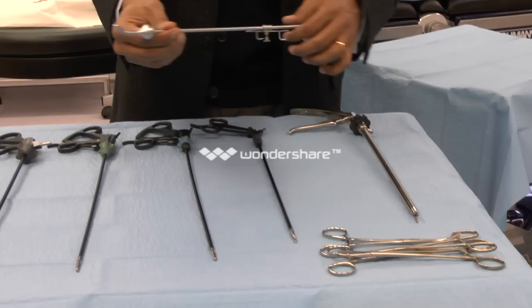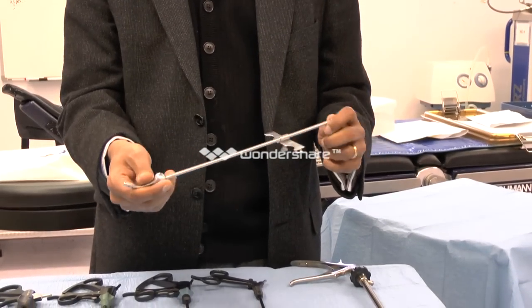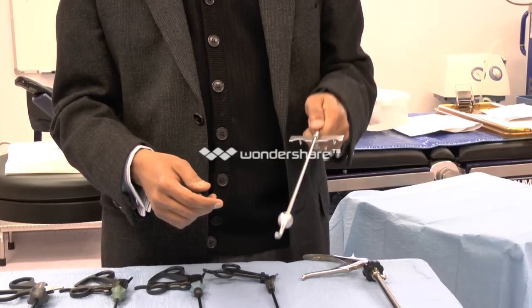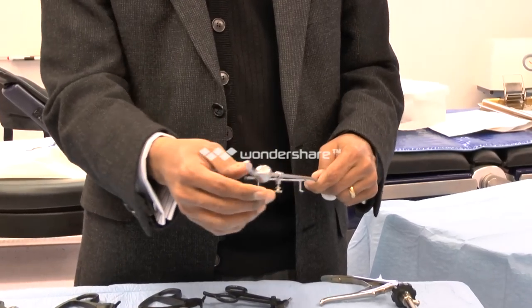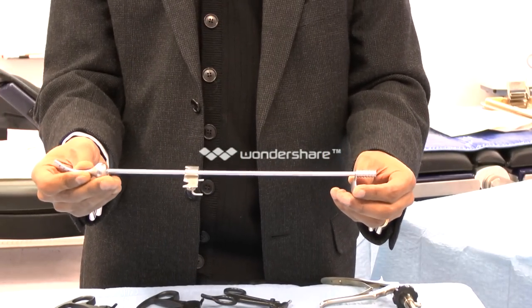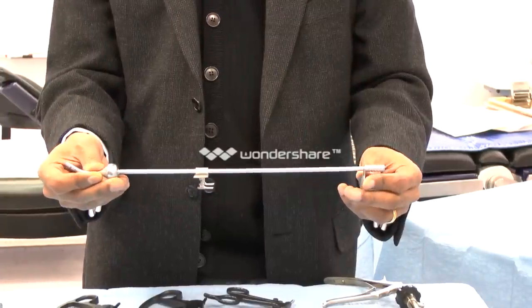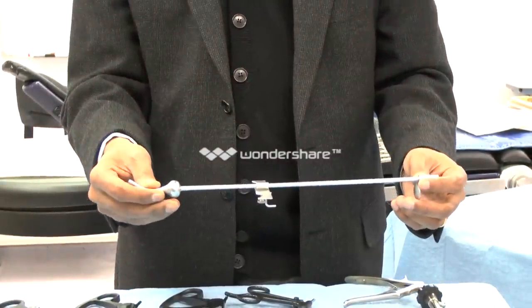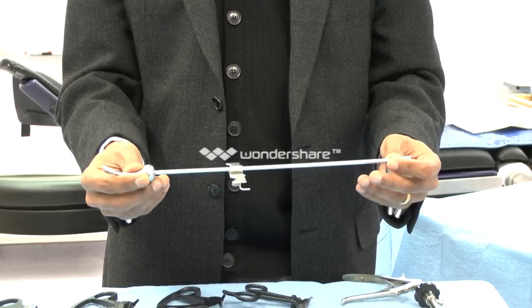This is a uterine manipulator, which is inserted into the cervix and the uterine cavity to help you elevate the uterus, antevert or retrovert it, or move it to one side or the other. The uterine manipulator enables the surgeon to visualize the pelvic spaces — the vesicouterine pouch, the pouch of Douglas, and also the adnexa clearly.